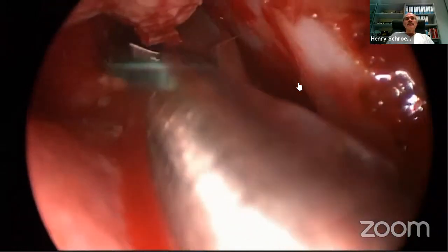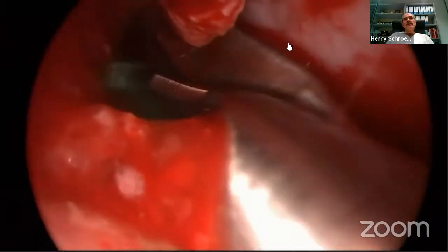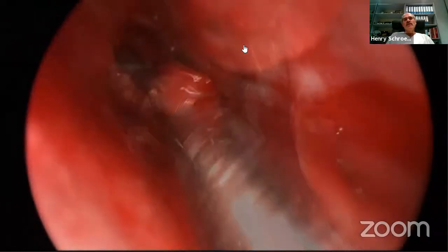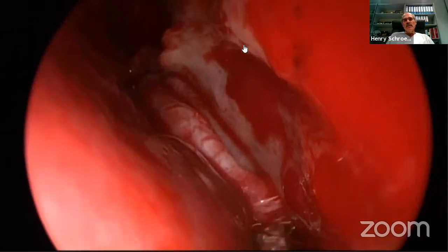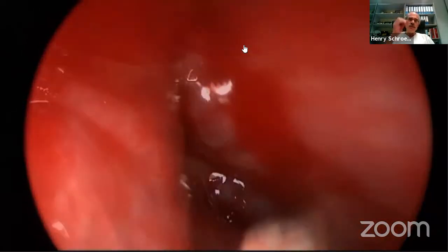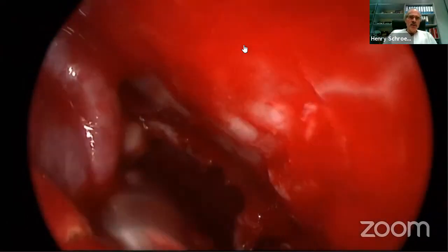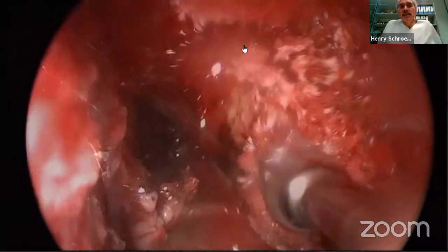Otherwise you get trouble with your ENT. And then we stay 1 centimeter below the skull base and make the upper cut. And then we store the nasoseptal flap in the pharynx, or if you want to go to the caudal part, we put it into the maxillary sinus.